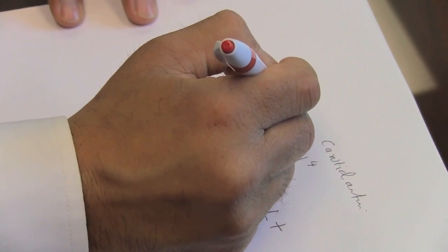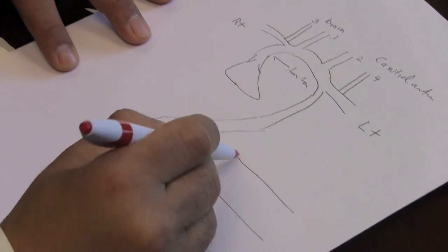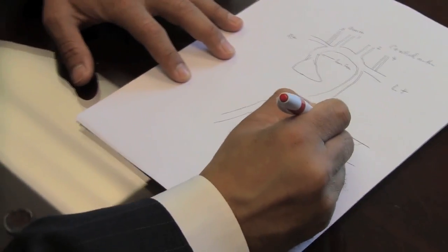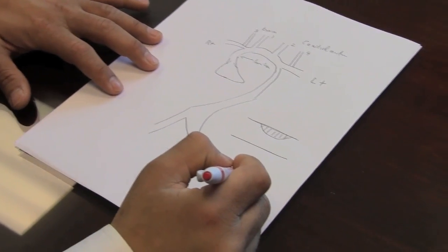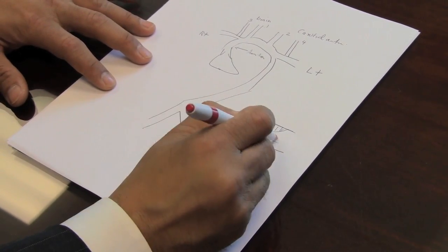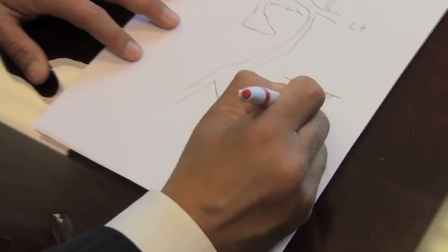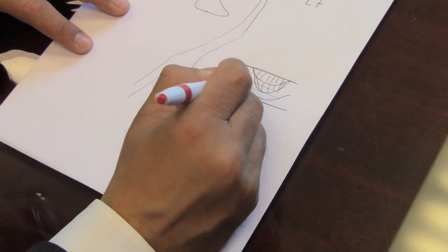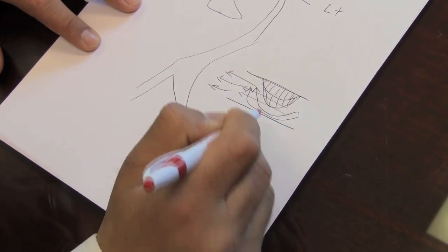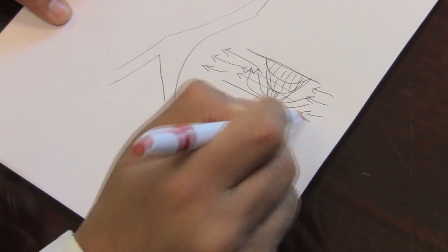When the carotid artery develops blockage, this is the normal artery. This is the way a normal artery will look. When it develops blockage, the plaque buildup, we can see in an ultrasound how the flow is going through the blockage area. As the blockage gets worse, you can see now the blood flow has to make a space around it and then keep going. And then eventually the artery is completely blocked. The blood just cannot go through it.